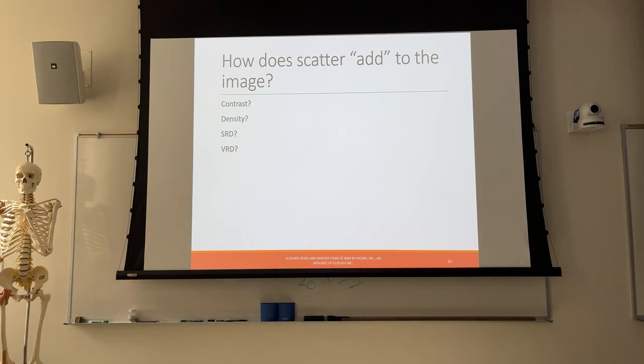Density, remember that's the dicey one. Density really, again, equate exposure here. It will change your tissue density. The difference in tissue composition will change tissue density, but in as much as changing the appearance of the image because of the contrast present, not really. Computer algorithm kind of fixes that. So there's a lot tied up in density. The scatter radiation lays down a layer of density, but it doesn't necessarily mean that you're going to visualize that density. What's going on with the tissue? Do we have a condition that changed the tissue composition? In that case, it's going to change the density. But in as much as the density on the image and the perceived density, it might change your exposure some, right?